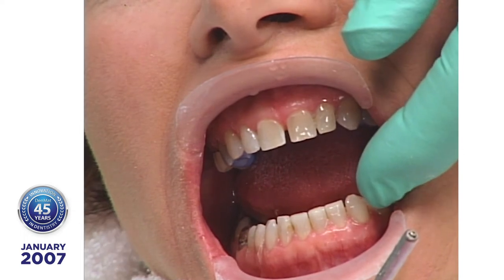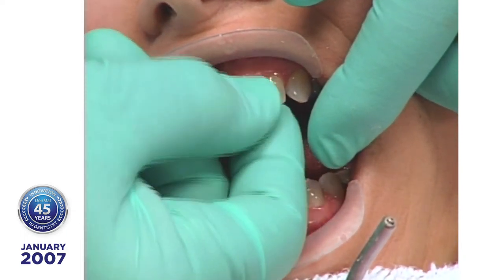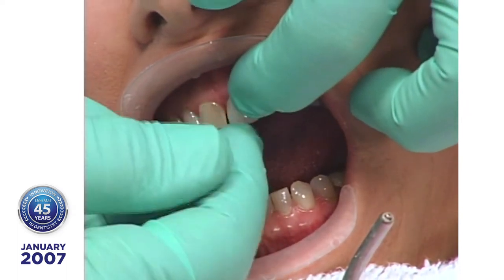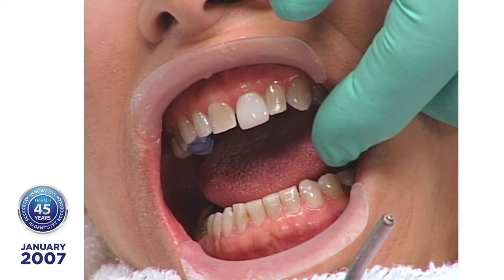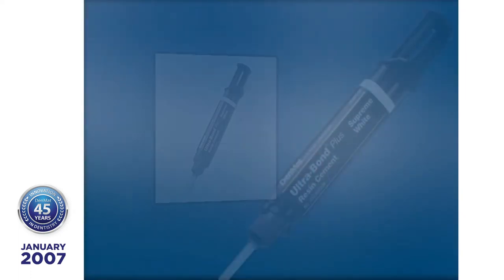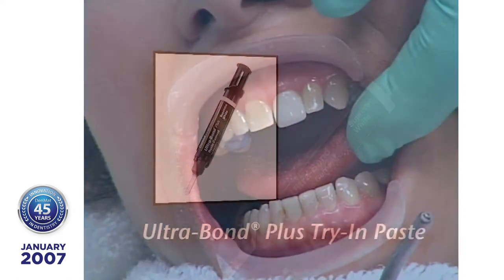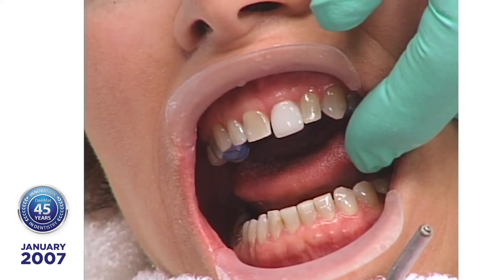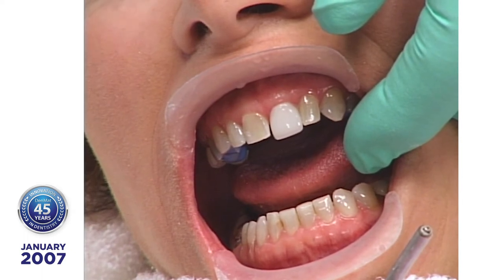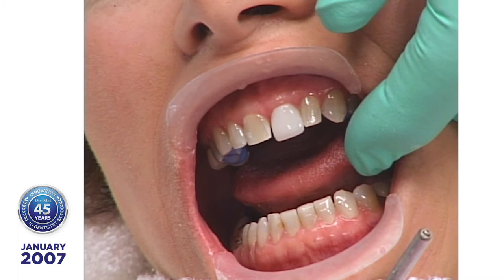We're ready to do a couple of try-ins. Lisa always calls out the name of the tooth — left central. We're going to use the Ultrabond try-in paste. First we'll see what it looks like without anything in it. The try-in paste is the same as Ultrabond paste, except it doesn't have any activators in it — that's the big difference.